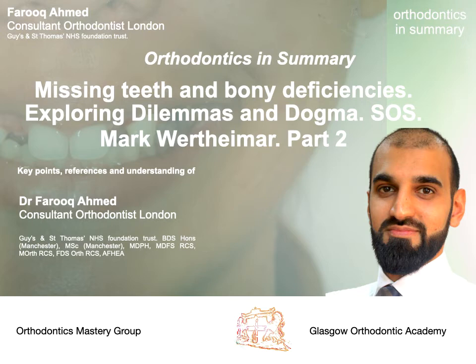This is the idea of placing the mini implant or the miniscrew into the hypodontia region and therefore not allowing the atrophy of bone to take place. The question is, does this work? Well, in the paper by Al-Matia in the AJODO, it showed that 3 months after placing a miniscrew, the bone density actually increased in that region.